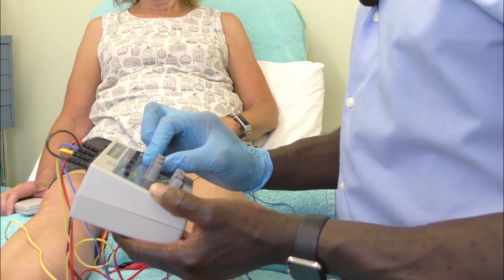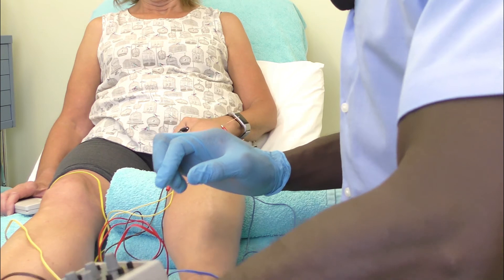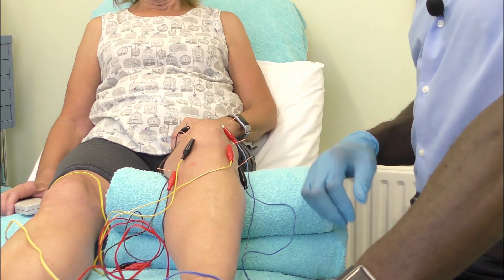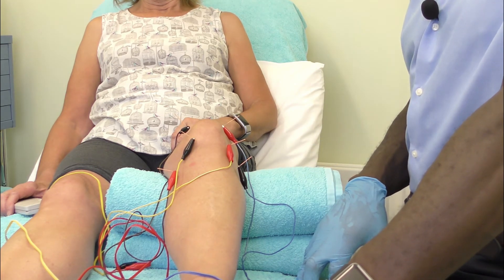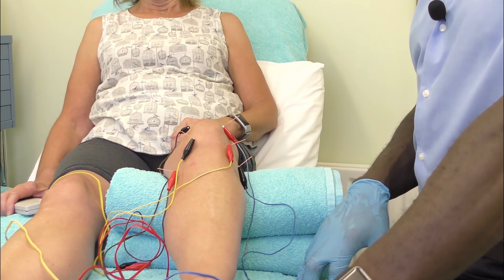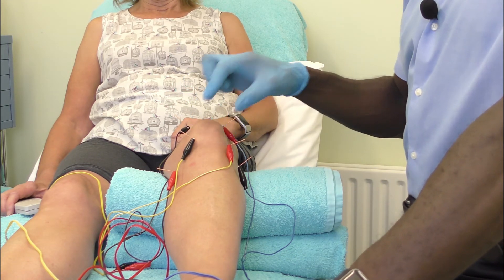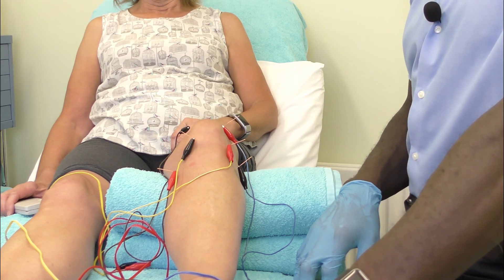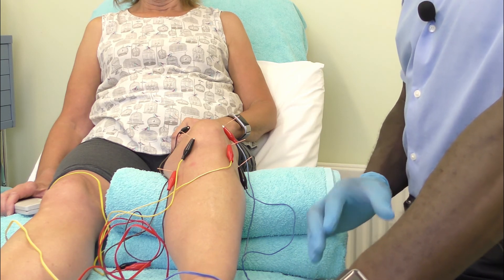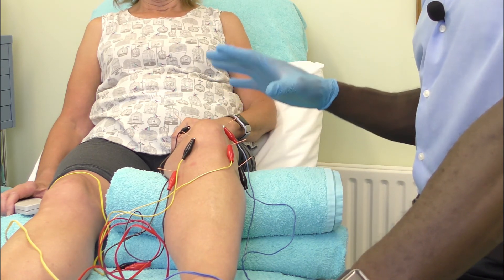If you notice, in this case I've only used a total of six needles. There have been a number of studies that have demonstrated results with five, two, and eleven needles, and what they basically found is that as long as you're using the eyes of the knee — those two main points — six is a good number to use. Ideally, if you're treating an osteoarthritic knee, six is an ideal number.